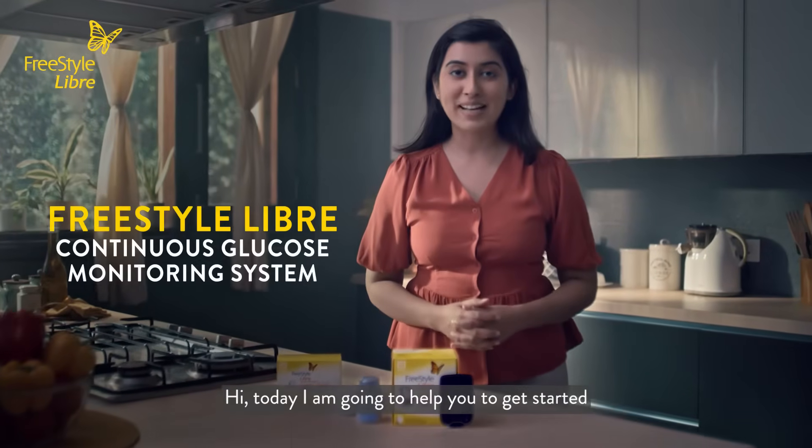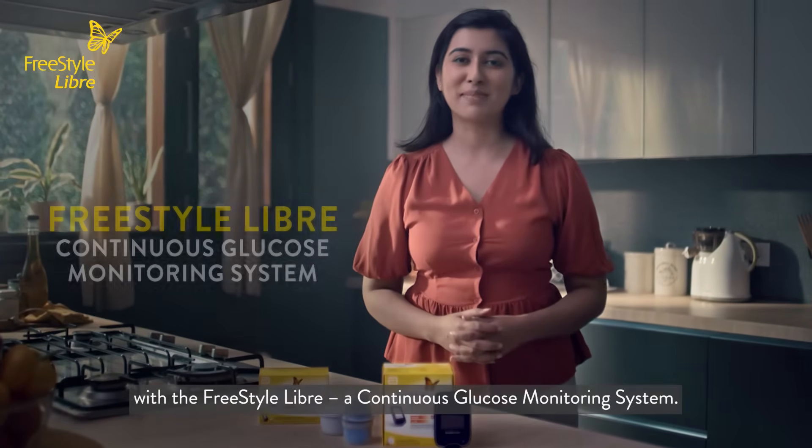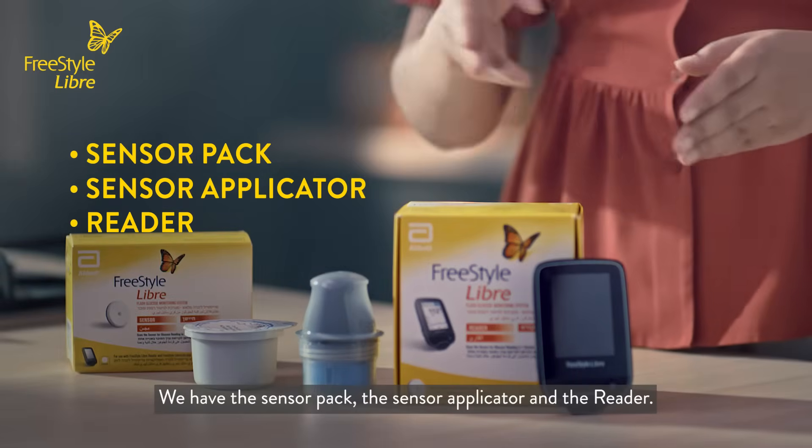Hi, today I'm going to help you get started with the Freestyle Libre, a continuous glucose monitoring system. Let's go through the main components of the Freestyle Libre system. We have the sensor pack, the sensor applicator, and the reader.